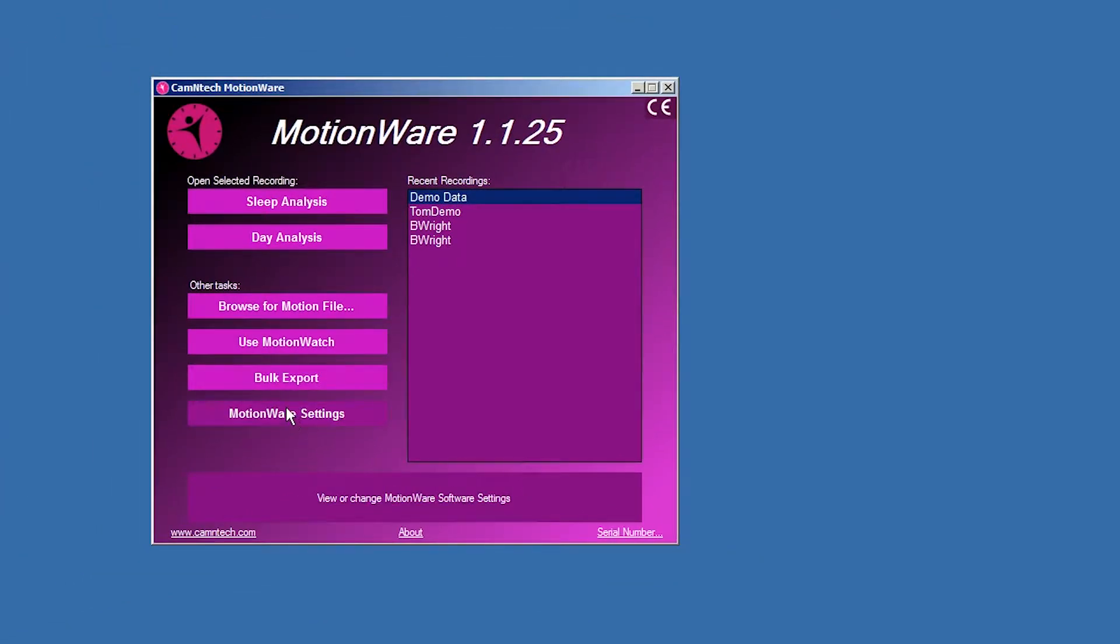The software will check for updates every time it is started. Click Cancel to ignore the message and disable the automatic checking. Note that an internet connection is required to check for updates.